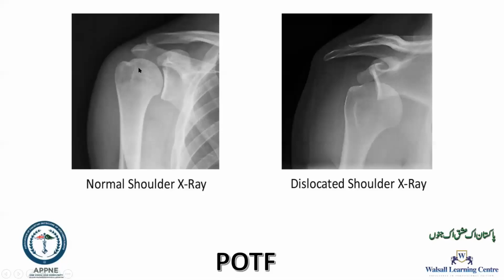Okay, so this is a normal looking shoulder, and the way to look at it normal is.